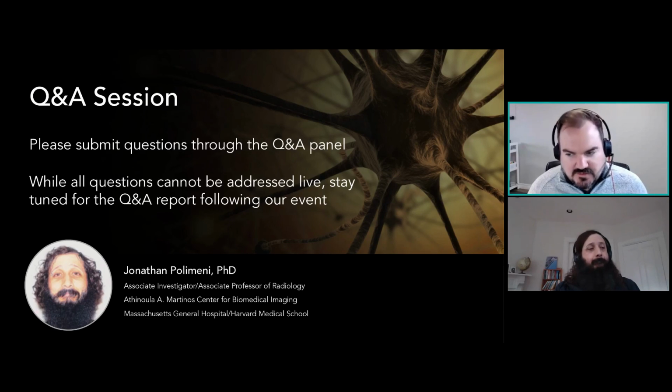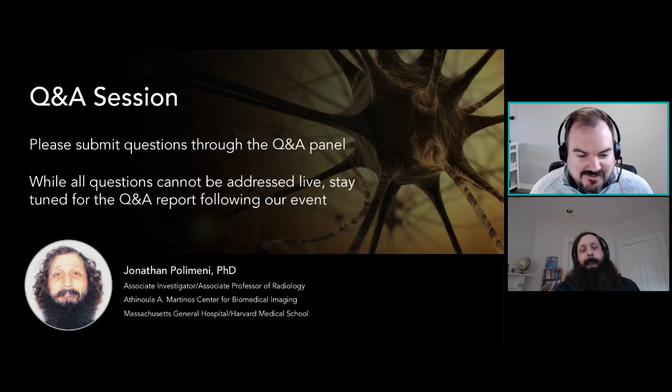But generally, I think that of all the tools we have available to us today, fMRI at least provides the best coverage across the brain and sensitivity across brain structures at pretty reasonable spatial resolution. And as you're seeing, we are certainly improving the temporal resolution as well. It's going to be a while before we reach the temporal resolution of optical, maybe never. But I do think that these techniques are complementary, and depending on the brain region of interest, one may be more suitable than another. And my impression has been that the trend towards an increasing number of MR compatible pieces of equipment is certainly growing as well, right?